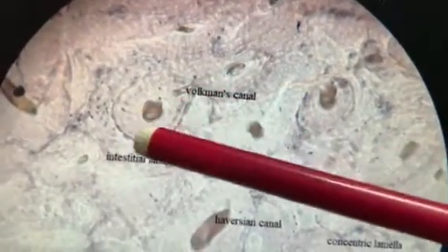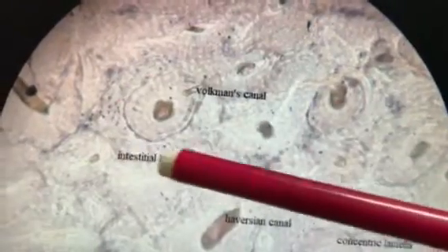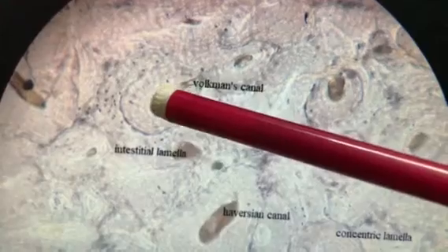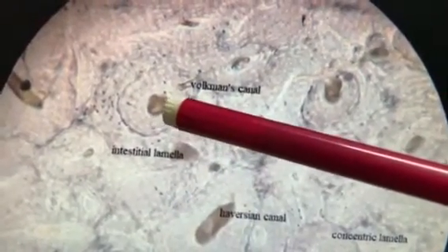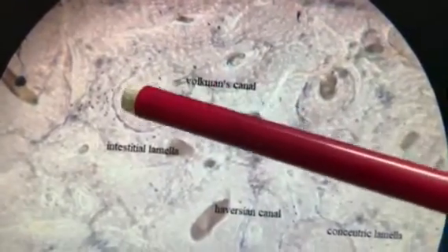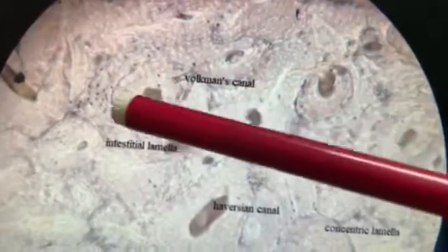This is called concentric lamellae. So we will ask the second question, what is this? The entire system is called an osteon, and each osteon contains one Haversian canal. What is the content of the Haversian canal? We will ask. It carries 1 mark. Second, the concentric lamellae you will answer. So we will ask, what is a lamella? A lamella is a thin plate of bone, and what does it contain?